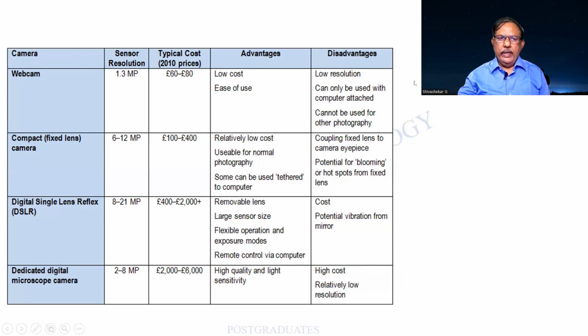So these are the components of it. These are the various components and what they are being used for. The only thing we must realize is that an ordinary static camera will be of low cost, but as you go down, it will become expensive.